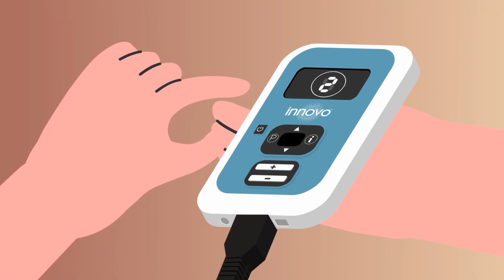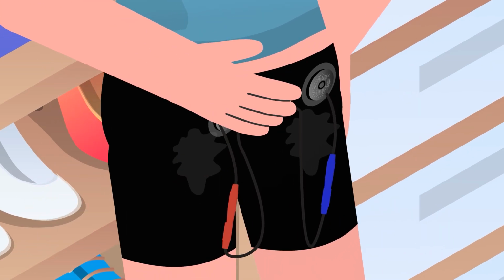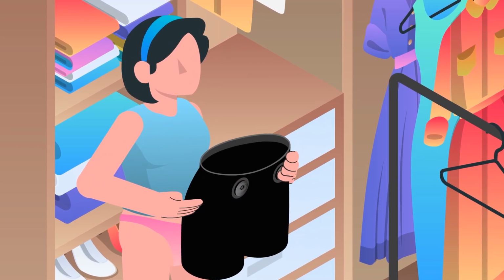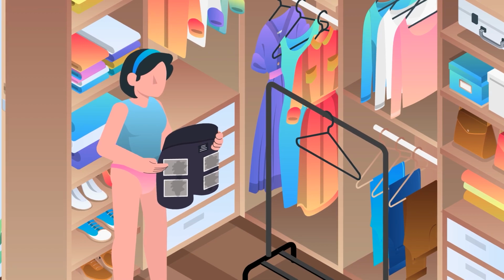After your session, press the on/off button for 2 seconds to switch the controller off. Remove the cables from their sockets. If the shorts are damp, use a cloth to wipe them dry. Proceed to remove the shorts by pulling the waistband down.